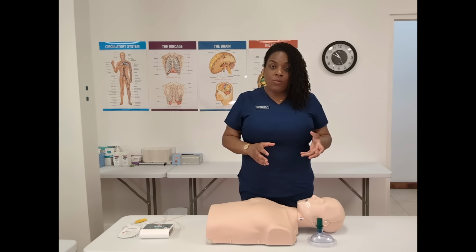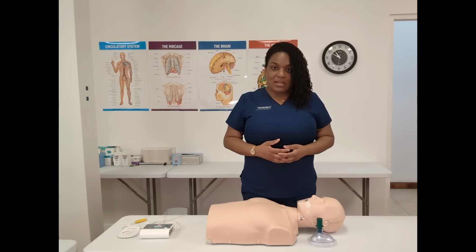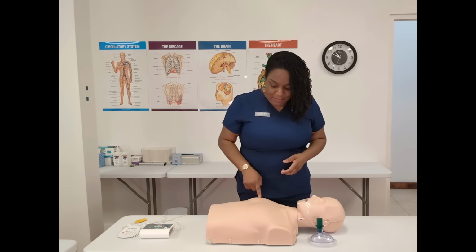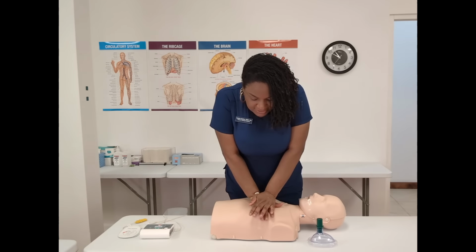But that fear, I hope to negate that today and to decrease it, because we need for you to save a woman's life the same way you save a man's life. Hand placement: center of the chest. You would then take your shoulders, and your shoulders should be aligned with your hands. You're going to press straight down.